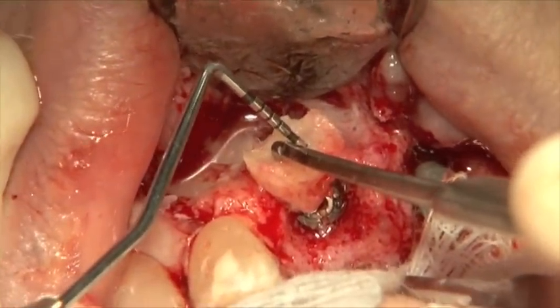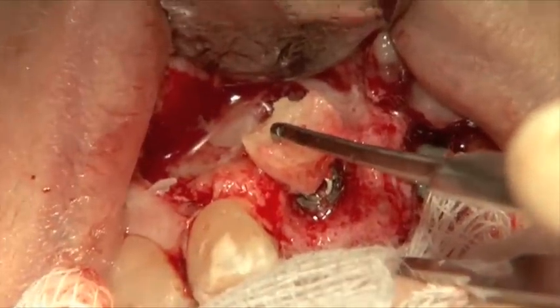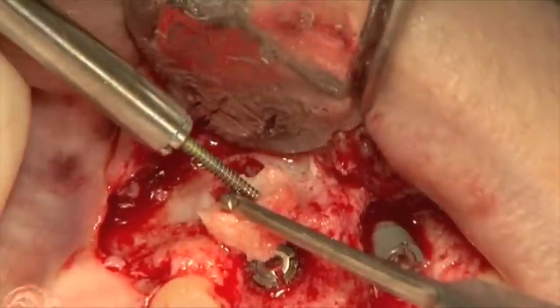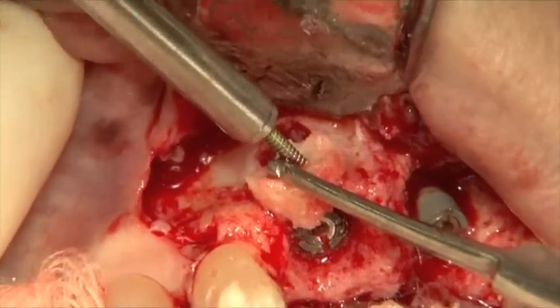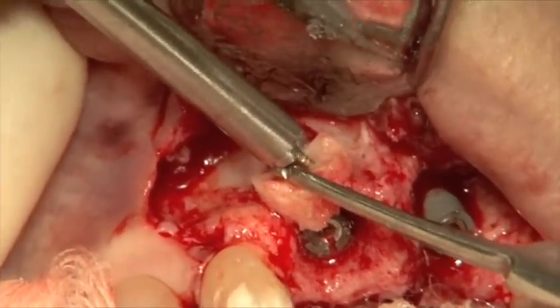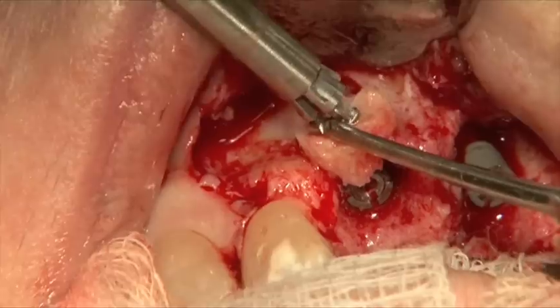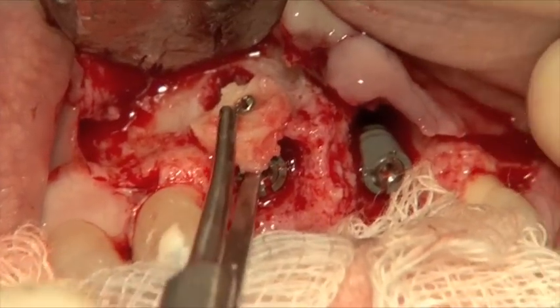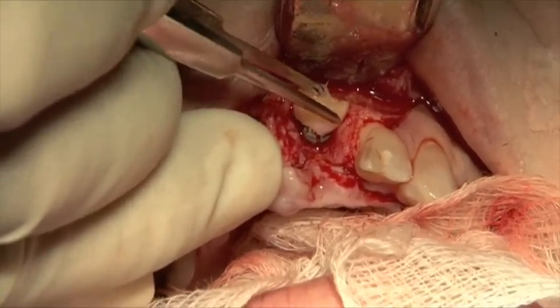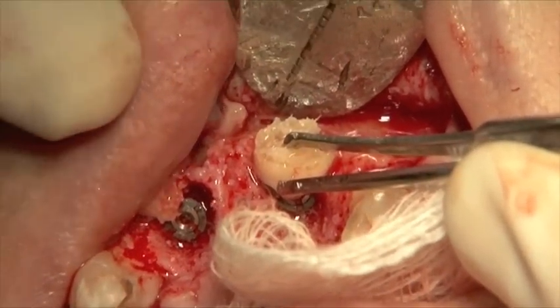You can see one way — I'm checking to see the depth. Can you see now? I can see my depth. What am I going to use? I'm going to use a... that goes in — it's a nine millimeter. So I'm going to use a nine millimeter screw. I'll give it a very deep head. There you can see — nice and thick. There you can see how nicely that fits in. Now that's shaped. Also about nine millimeters — this is what I'm going to do.